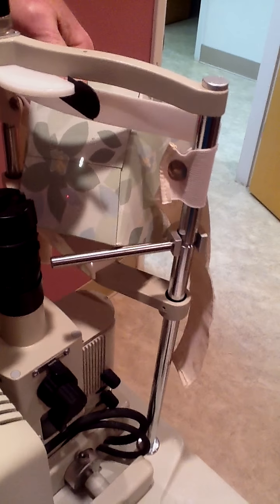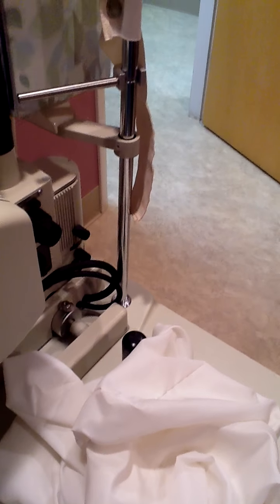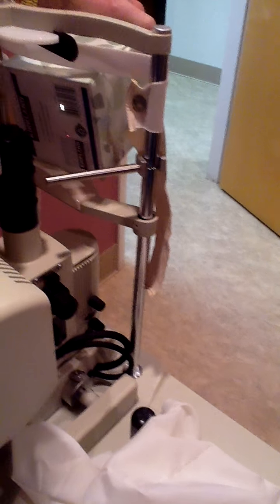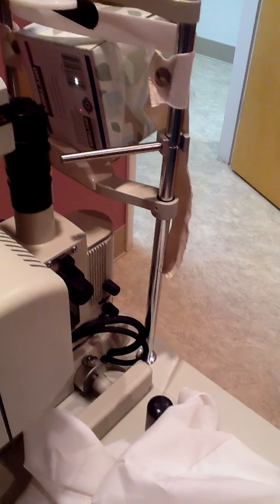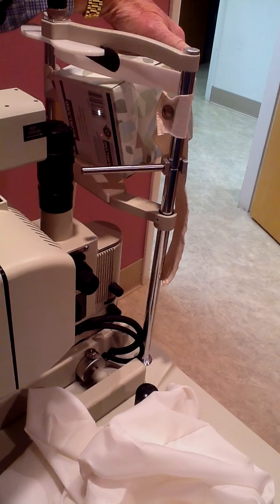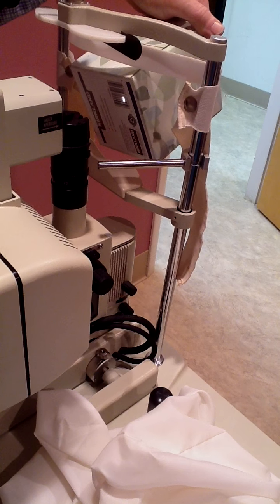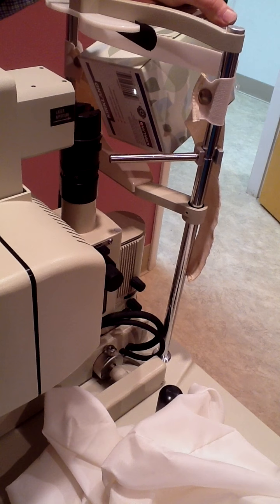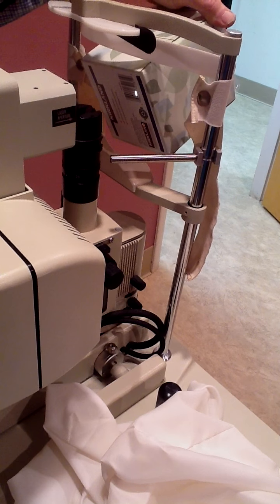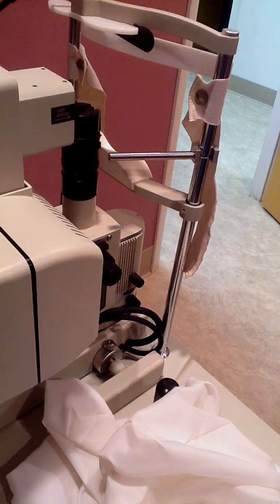There is a technique to getting this done. You want to put the YAG beam on the capsule, not on the lens, because you can get pitting if you do it on the lens. There we go — that's working great. You're going to see two red lights; you've got to get the light into a single beam. So this is working very nicely.